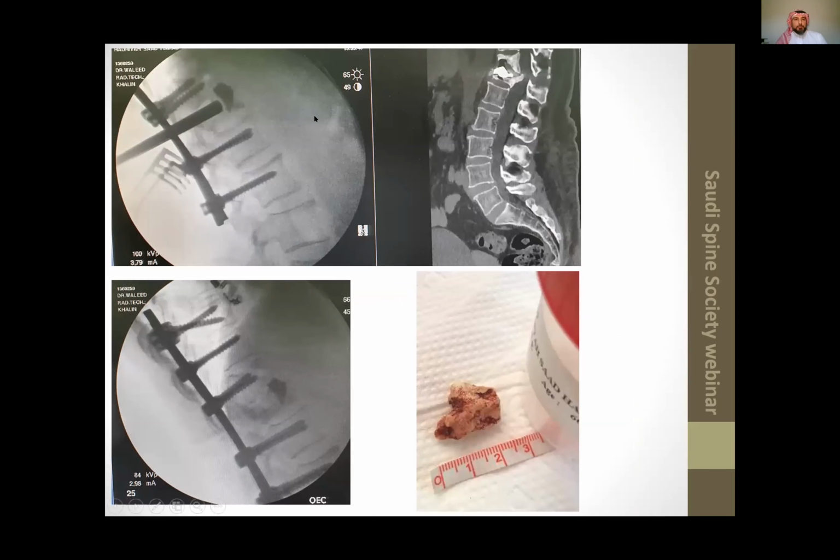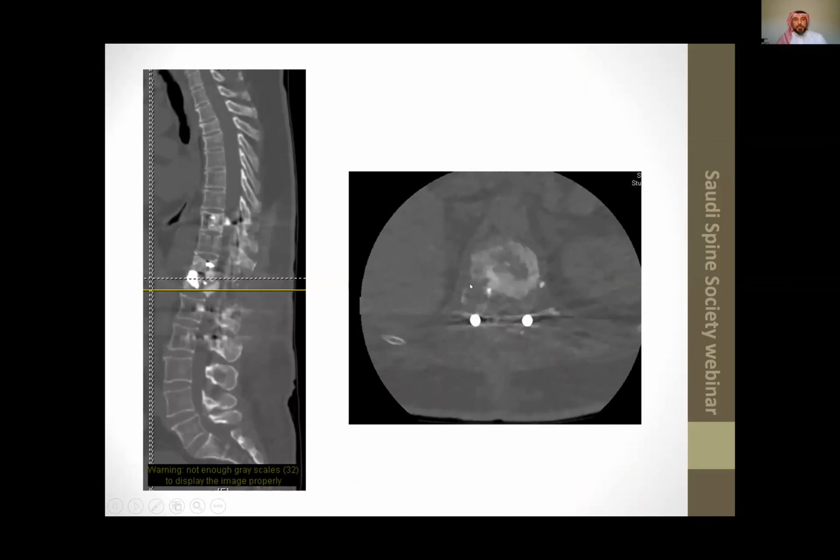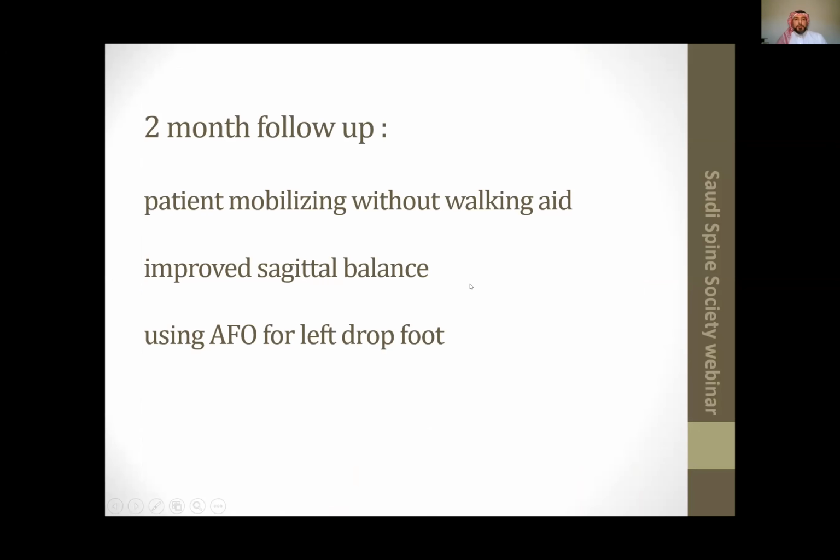This is the picture intraoperatively. This is the side where the cement was in the canal, where it's removed. The other side of the cement was flipped longitudinally to act as anterior column, and using a funnel, we pushed more cement to fill the gap, with monoscrews above and below to keep the structure. This is the CT scan where you can see the cement longitudinally, and the posterior decompression, where the posterior wall and the pedicle are completely removed. She's 2 months post-op.